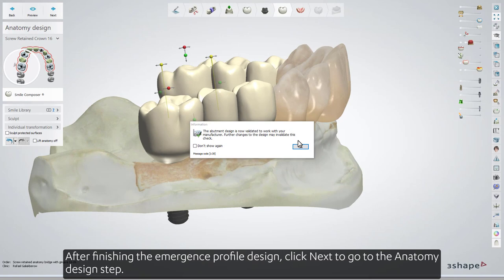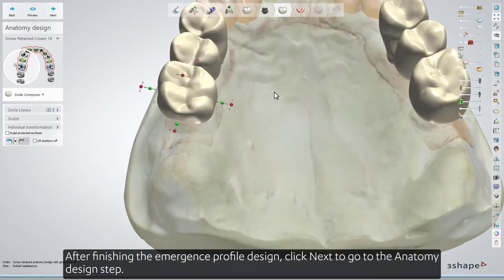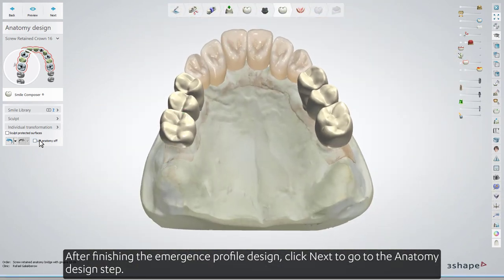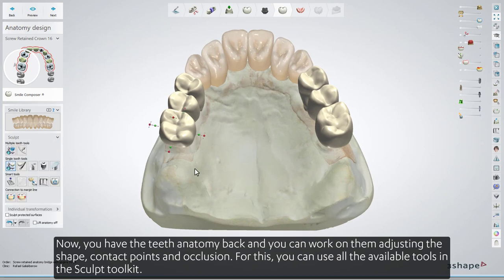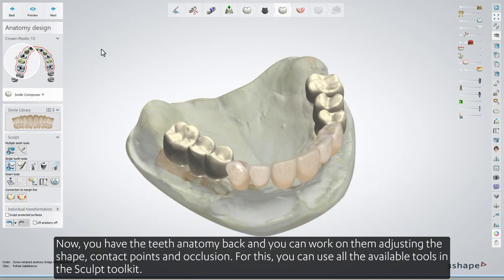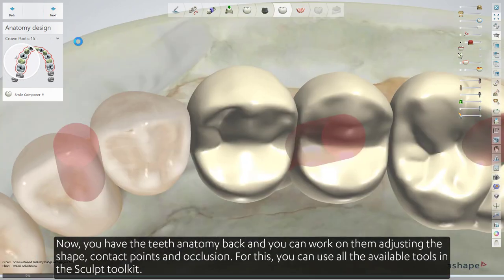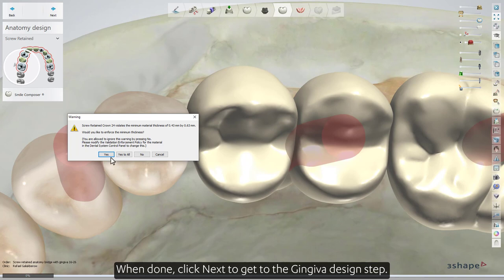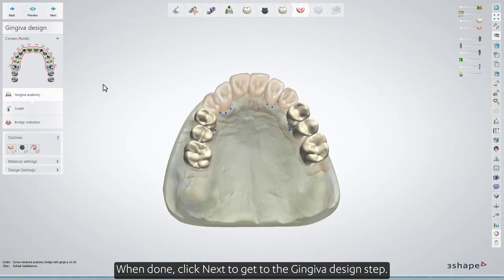After finishing the emergence profile design, click Next to go to the Anatomy Design step. Now you have the teeth anatomy back, and you can work on them adjusting the shape, contact points, and occlusion. For this, you can use all the available tools in the Sculpt Toolkit. When done, click Next to get to the Gingiva Design step.